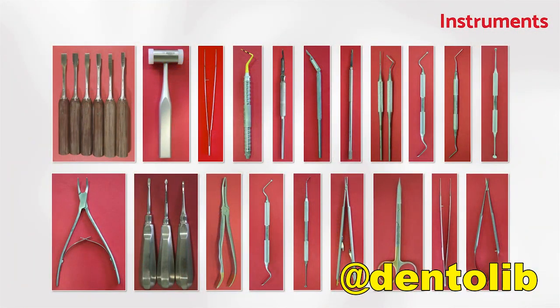And how about the instruments to be used to apply the IDR technique in your patient's mouth? Here you have all the instruments that you need in your daily practice to use this technique. You can see here the IDR chisels, the hammer, tweezers, the probe, mini levers, atraumatic forceps, a rounder, serrated curettes, all you need.